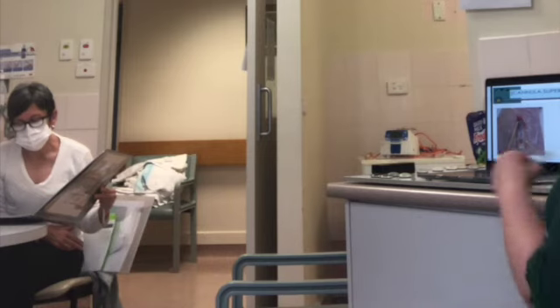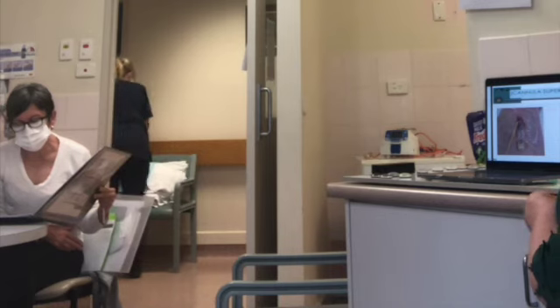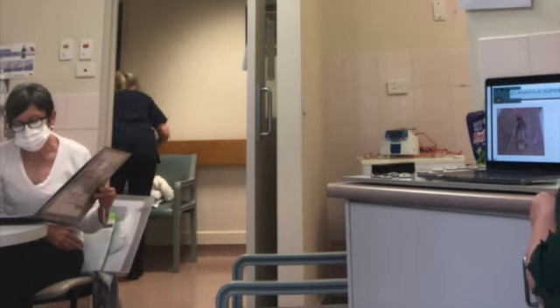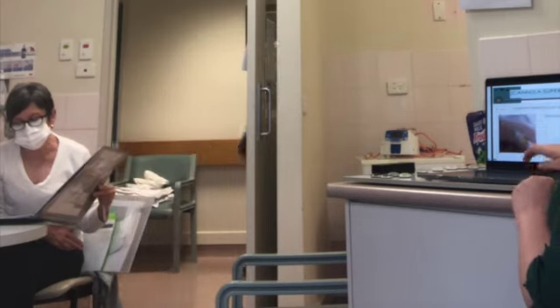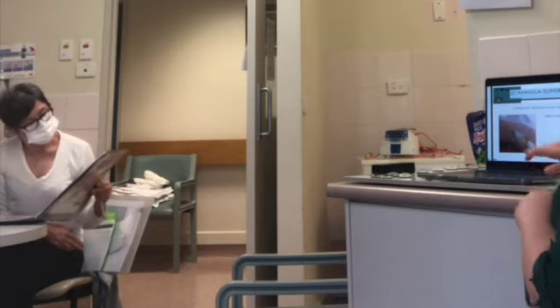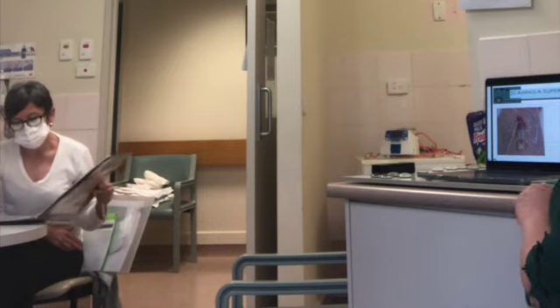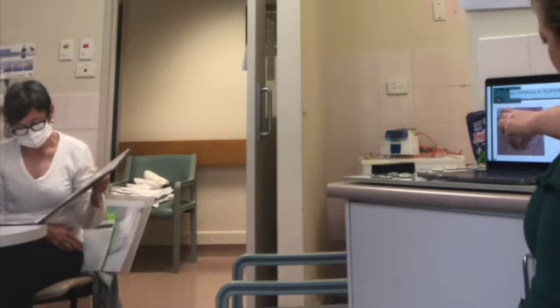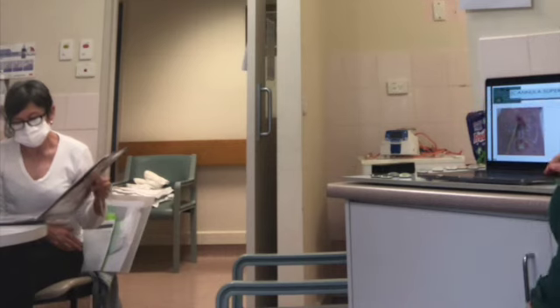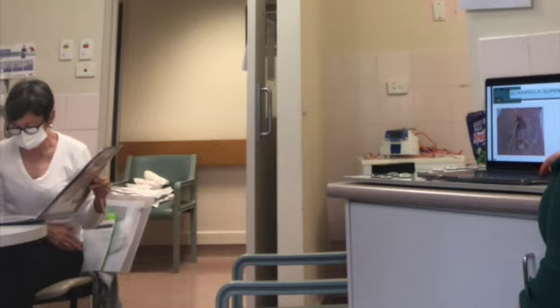What about this one? What are the similarities there? They haven't secured it before they put the film over the top. They haven't got the right bung on it. It doesn't look labelled. That was the point of the last one too. There's no date on that. And again, it's a needle access port. And if you just did a little tug on the end of that, or the patient did a little tap in the bathroom, you know where that's going to end up.